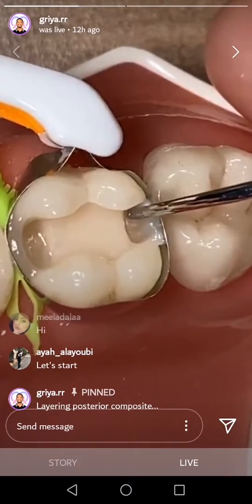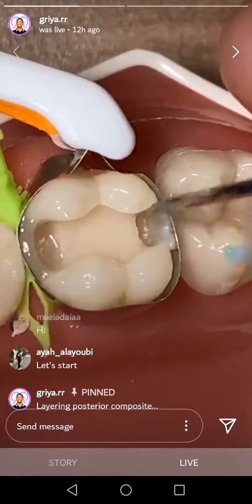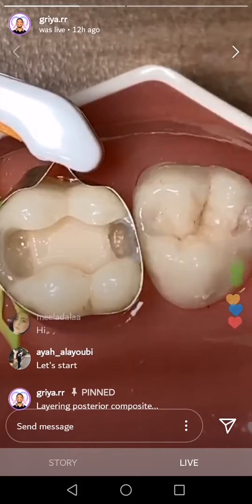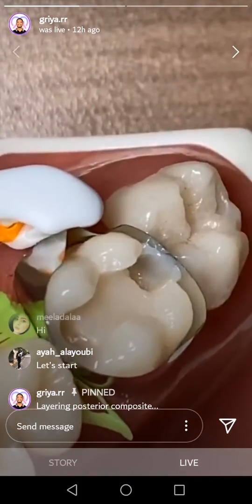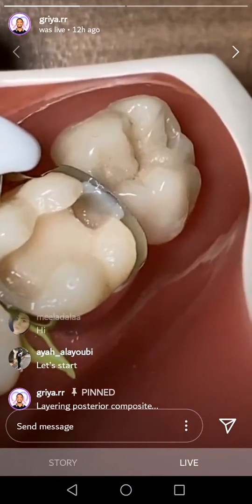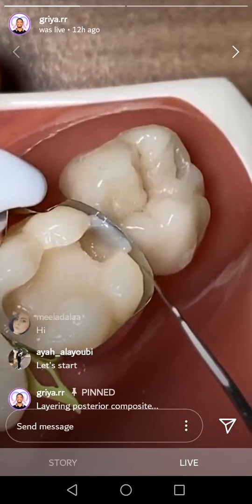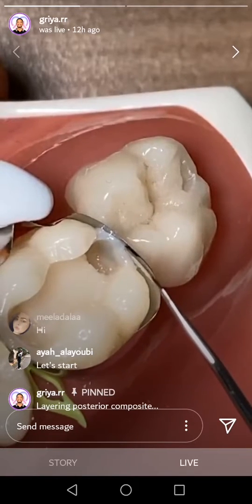Okay, just push like this, push, make it thin. Okay, make it thin like this. You can see they have an excess in here. So you can round it. Yeah, you can round it like this. Okay, make sure the same with this. Okay, you round it.